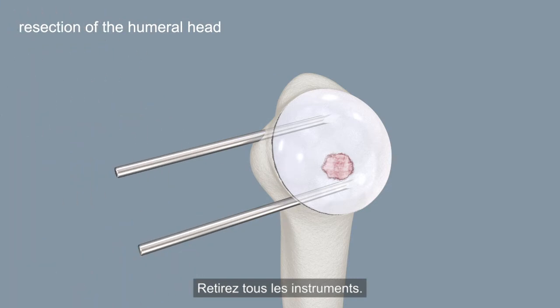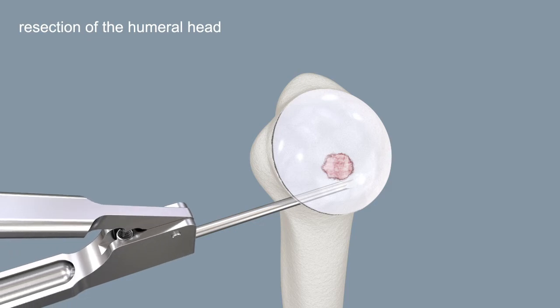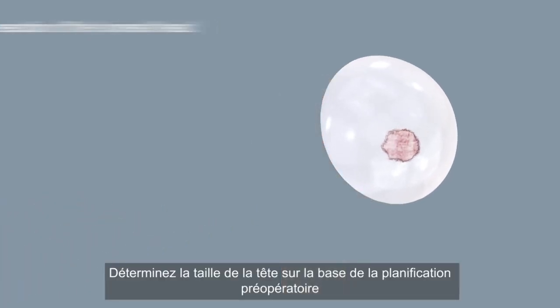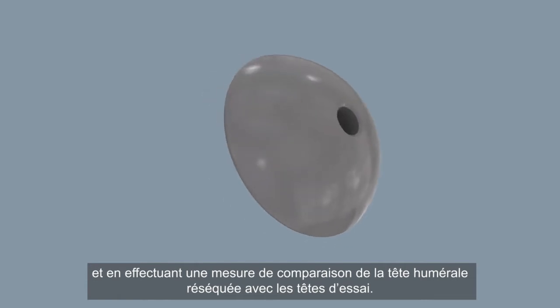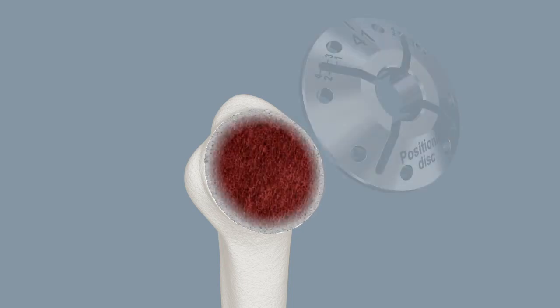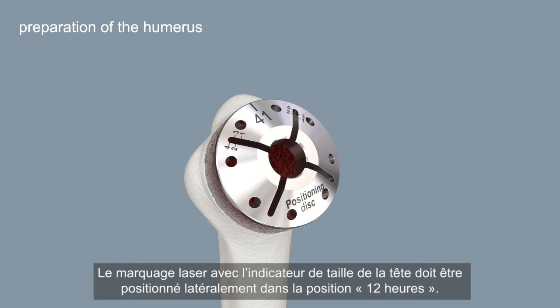Remove all the instruments. Determine the head size based on your pre-operative planning and by size comparison of the resected humeral head with the trial heads. Center the positioning disc on the resection plane aligned with the outer cortical border. The laser marking with the head size indicator should be positioned laterally at the 12 o'clock position.